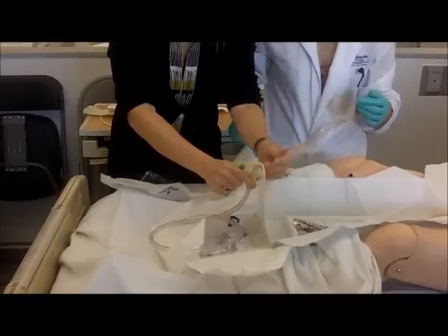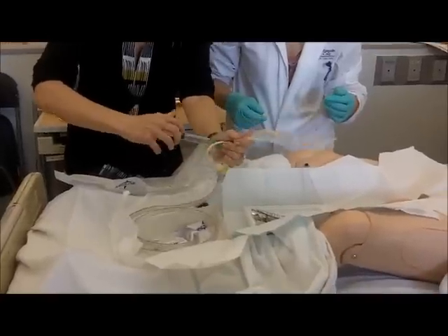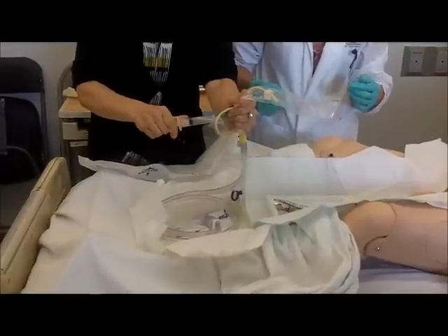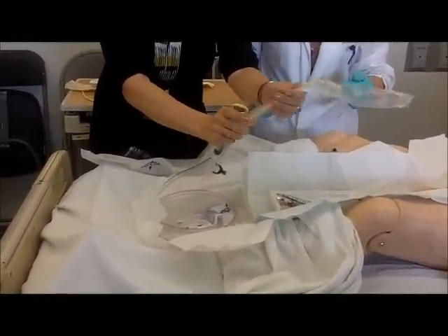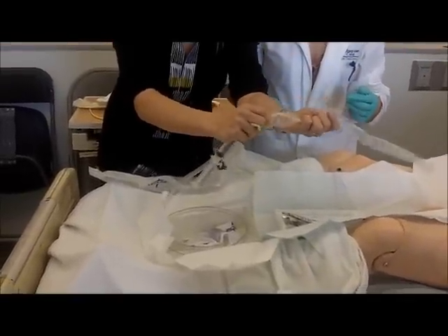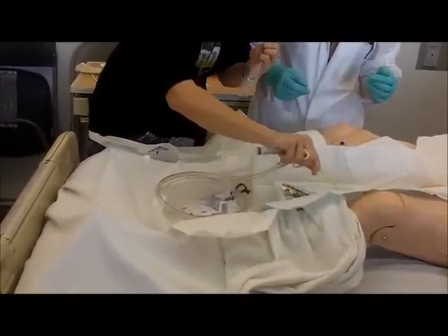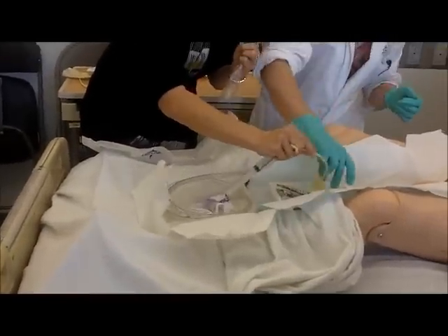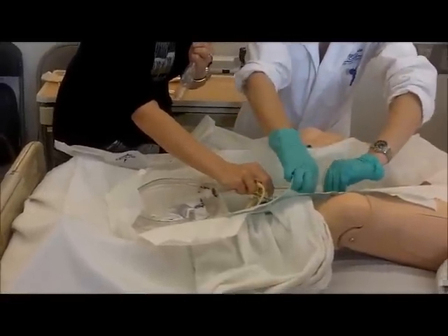My hands are sterile, I haven't touched anything. I take this out of the box. I hold it close — I'm sterile. I check my balloon. Good enough. I pull back, I'm still sterile. Take off my — I'm still sterile on both hands. I carefully take it off this way. Put it into my lubricant. And make sure that this does not go on the outside of the sterile field — that's the most important.